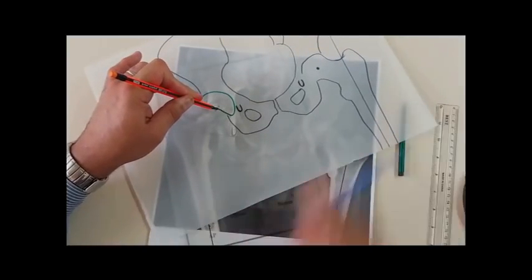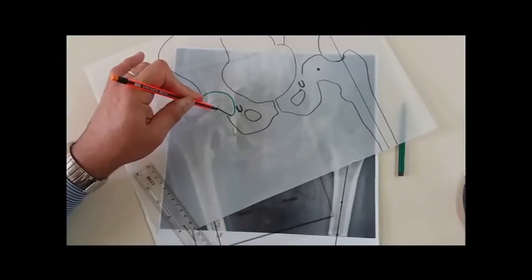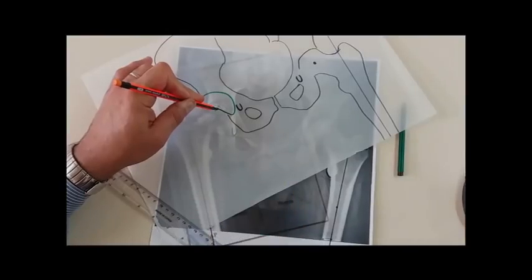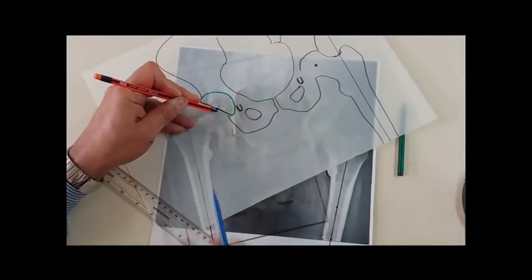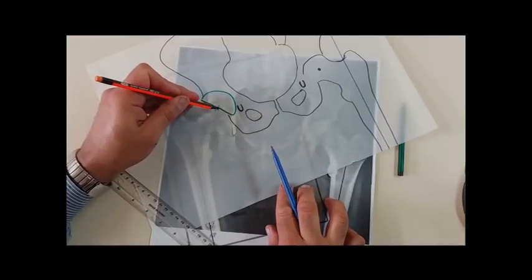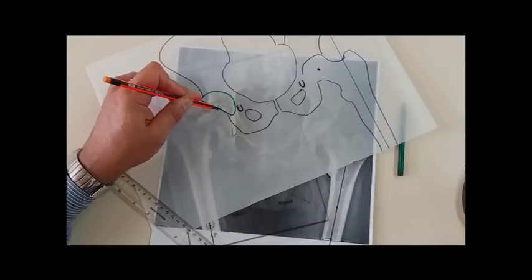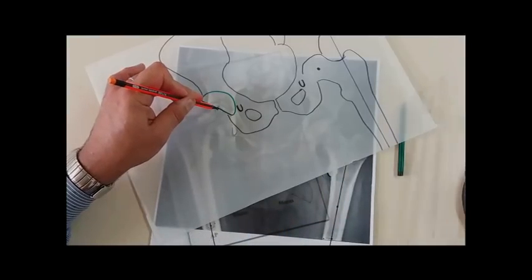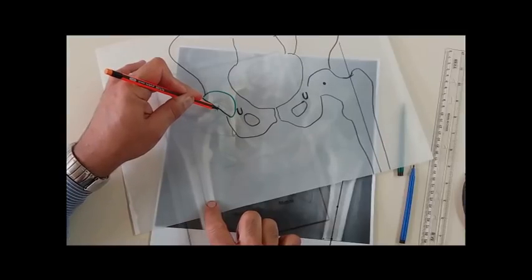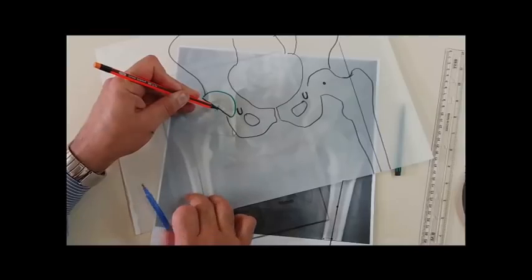This is not acceptable because the longitudinal line of the medullary is not parallel to the paper. So I will try my best to parallelize the rim of the tracing paper with that of the template or the medullary line. I think this is more perfect.